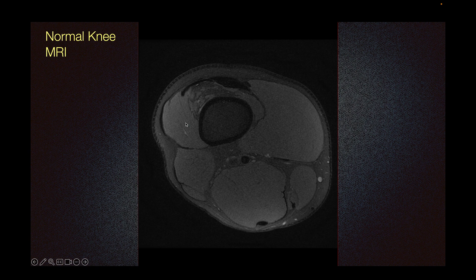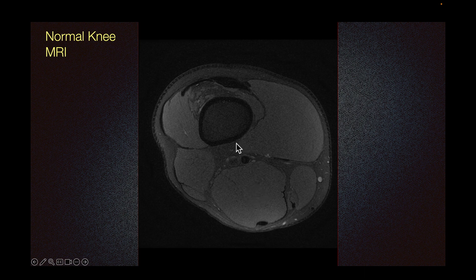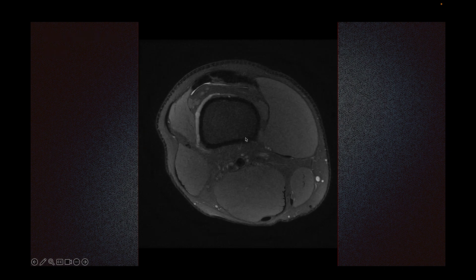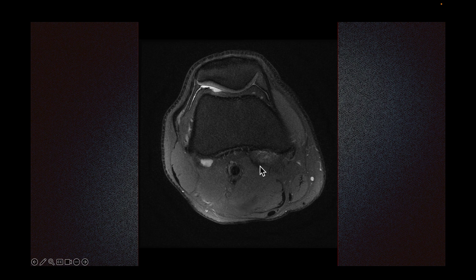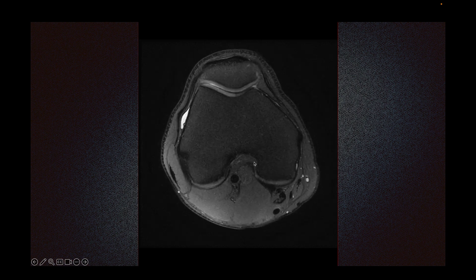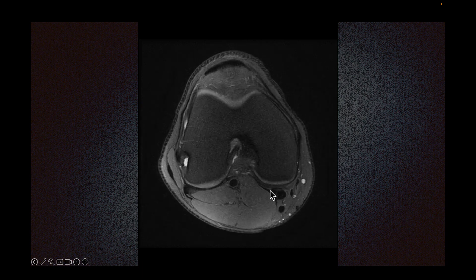Let's look at an MRI of a normal knee. This is the semimembranosus muscle, and this is the semitendinosus tendon. Sometimes this appearance is called cherry on top — the semitendinosus on top of semimembranosus. The medial head of gastrocnemius would originate somewhere around here as I scroll down. If there were to be a Baker's cyst, it would originate between the medial head of gastrocnemius and the semimembranosus.